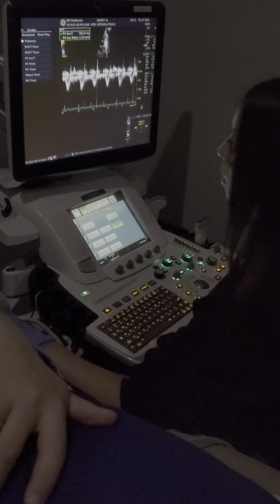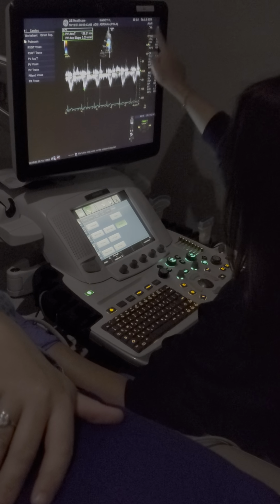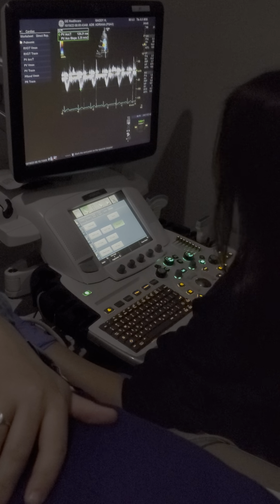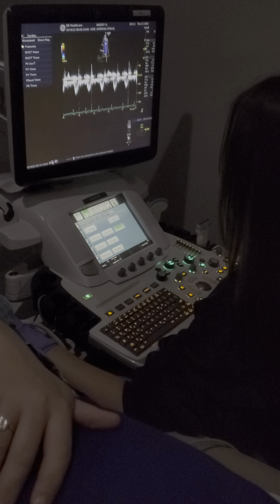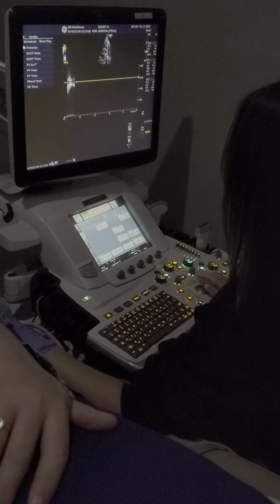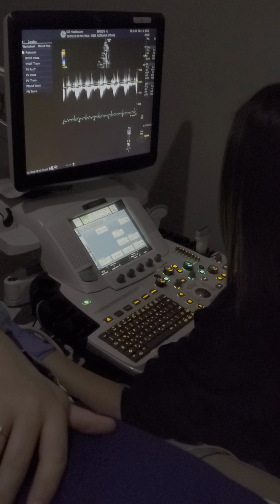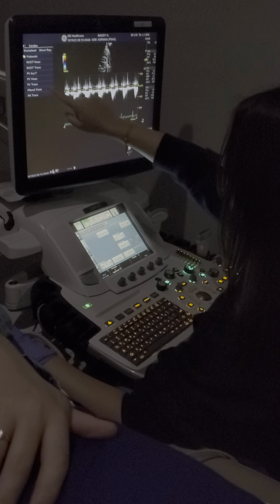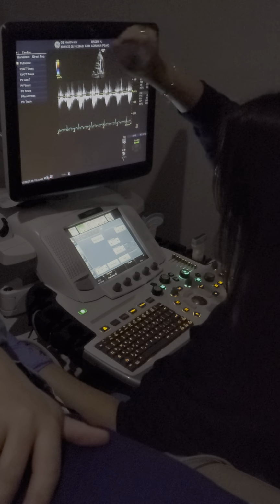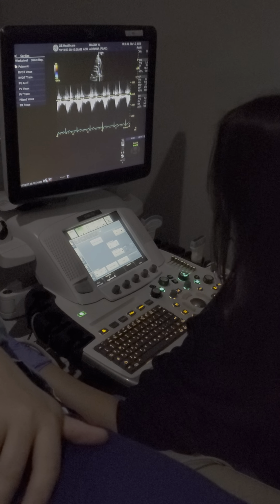Okay? Do you narrow for all of your PSAX waves or just? I narrow because it helps with frame rate. And it helps me just focus on what I'm looking at. Okay? So you do your pulse wave, then you will switch over to your continuous wave. And you'll VTI it like normal, which is the trace. Might be PV trace on these ones. Over there it's PV VTI. Okay, right? And we trace it like normal. Okay?